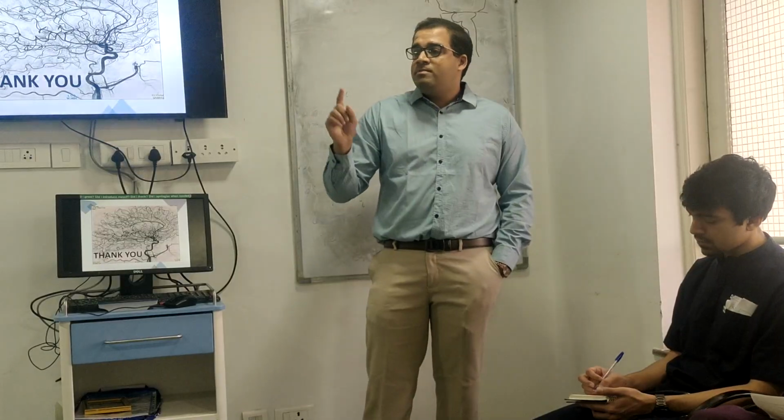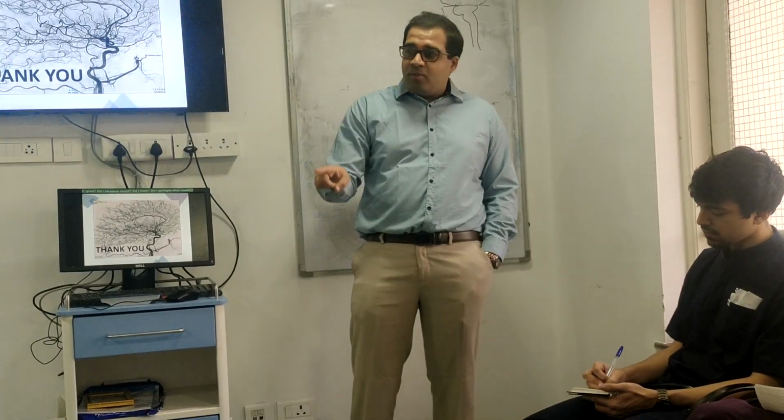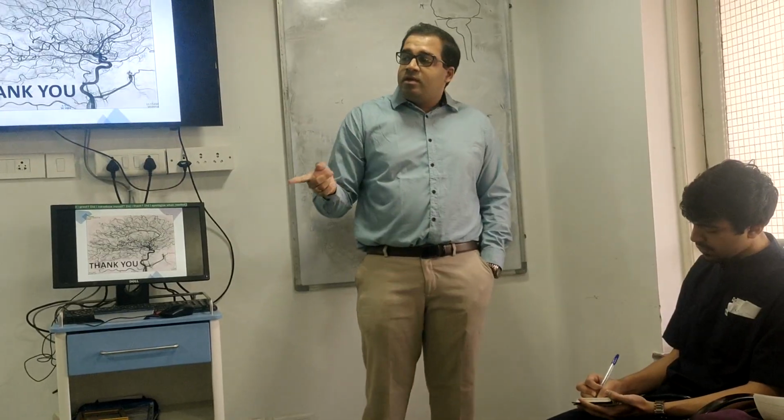Okay, blue top, yellow top is a Bactec set. Grey tops and purple tops are Bactec plus. उसमें से भी एक anaerobic bottle है, एक aerobic bottle है. Okay. Why does this make a difference? Why should you send both?